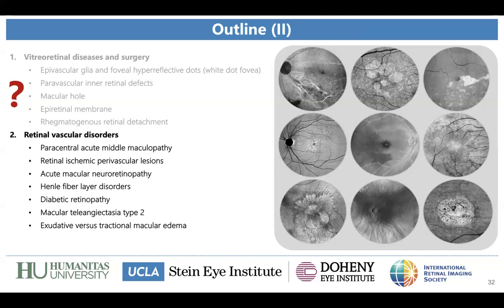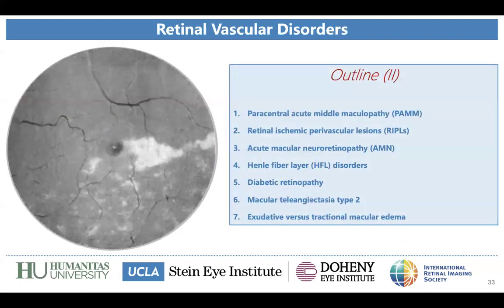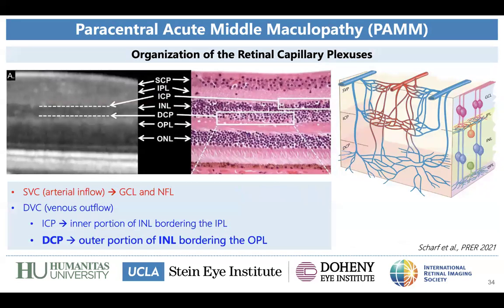So okay, if there are no more questions, I can move to the second part. Yeah. Okay, perfect. So let's now move to the middle retina and retinal vascular disorders. Before starting, just a very quick introduction about the capillary plexus.